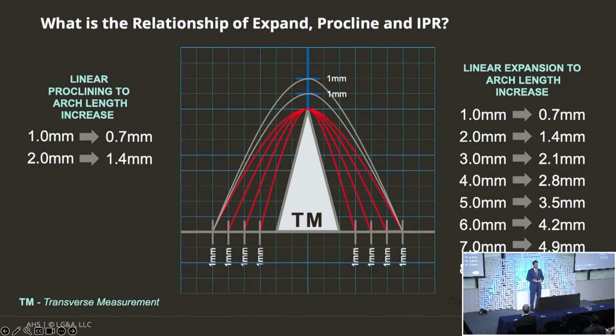Let's get this a little more complicated. Oh my goodness, it's super crowded. There's a blocked out tooth. I got to extract that tooth. Absolutely not. What's the measurement on a lower incisor? A lower incisor width could be 5 millimeters wide. What would it take to get rid of 5 millimeters of IPR? You send in a case that has a blocked out incisor. 3 teeth are touching and 1 tooth is behind or in front. Blocked out lower incisor. You know you need 5 millimeters of space for that tooth.